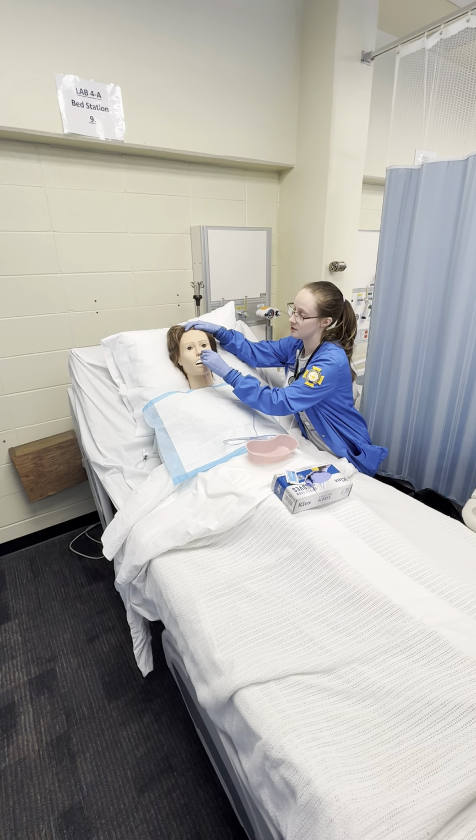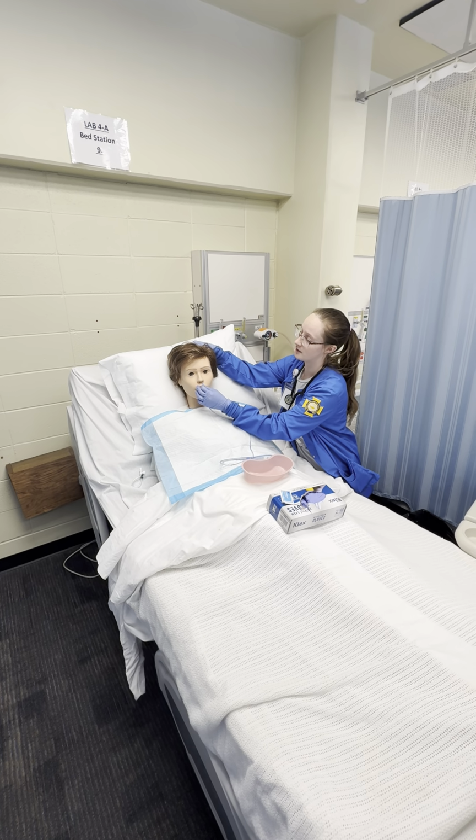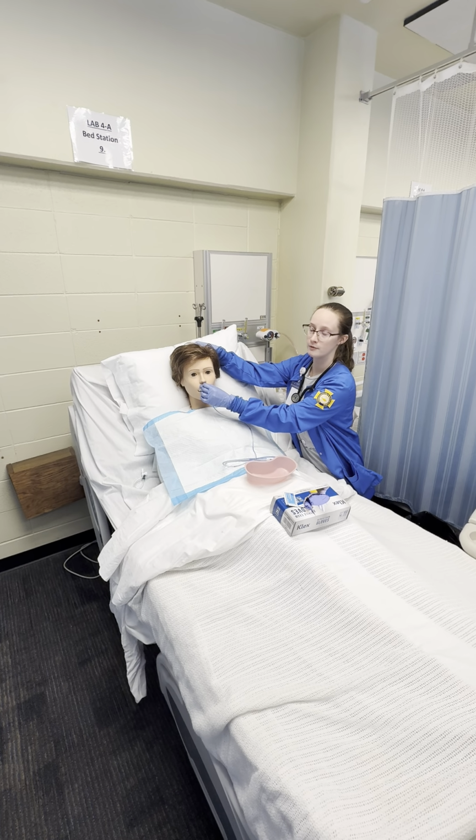Once the patient coughs or gags, it indicates that I have hit the pharynx, and at that point, I want to instruct my patient to go chin to chest, and I'm going to instruct them to swallow. I may supply them with a glass of water to help with their swallowing. So as they swallow, I'm going to advance the tube further, using no excessive force. Swallow, advance, swallow, advance.